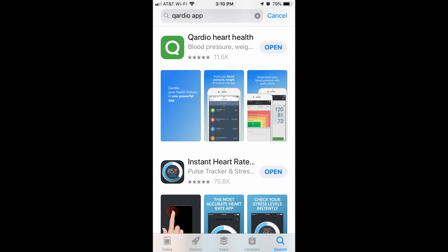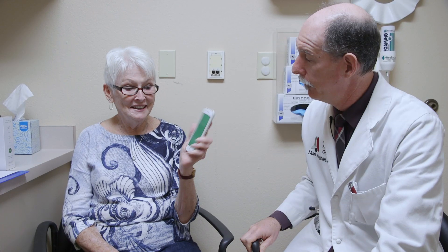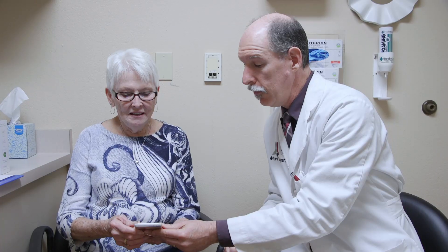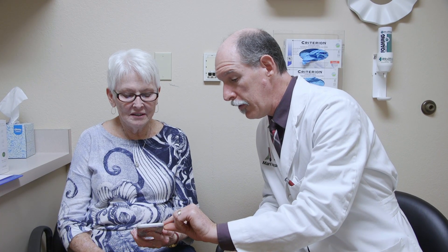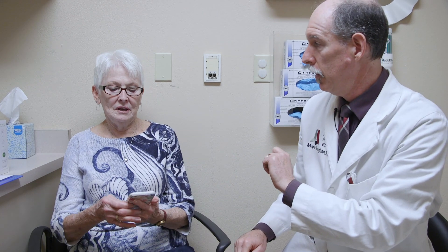Now hit Open. And what you will see is the green screen. It takes a while. So the first thing we need to do is create an account. Hit 'create account.' You can see there are a number of steps — it asks you to put in your first name, email address, and to make up a password.